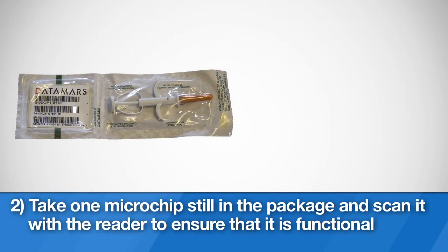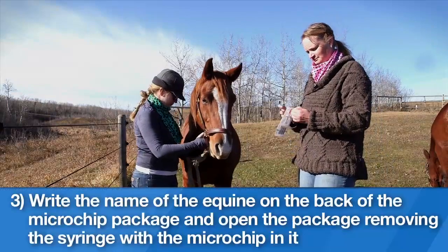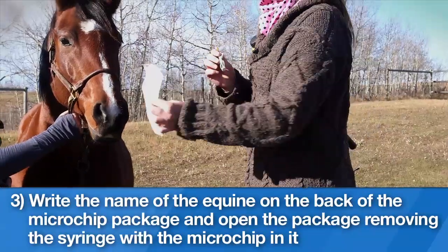2. Take one microchip still in the package and scan it with the reader to ensure that it is functional. 3. Write the name of the equine on the back of the microchip package and open the package, removing the syringe with the microchip in it.